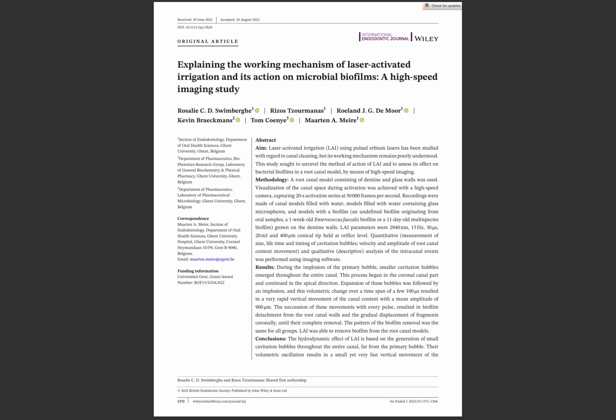In this study, they used a root canal model consisting of dentin and a glass wall to allow visualization of the canal space during activation, with a high-speed camera capturing 20-second activation series at 50,000 frames per second.